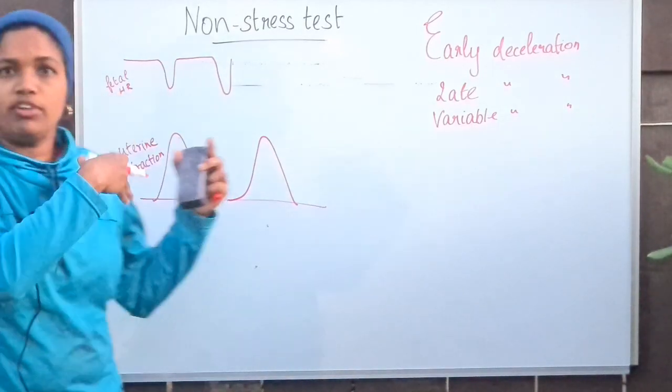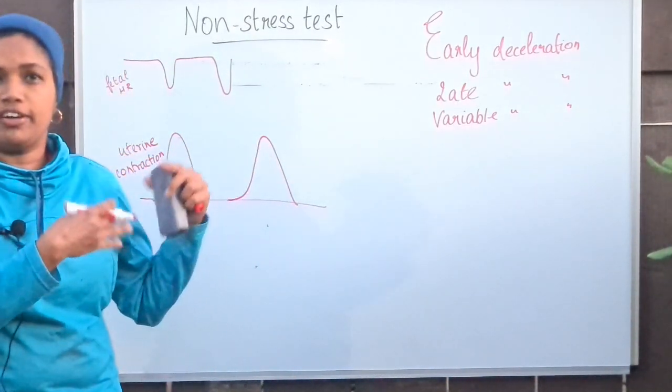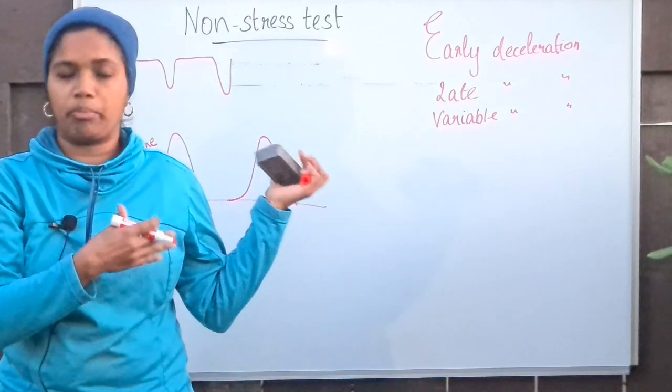So this relation will help us find a lot of what is happening inside.